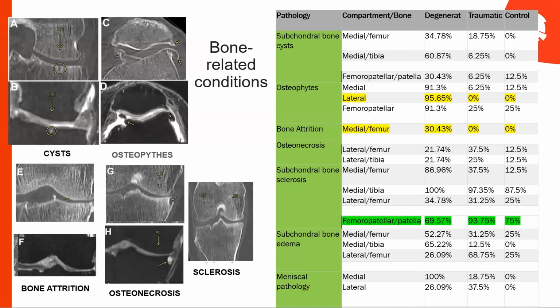While other parameters distribute among also healthy individuals, and some of the parameters, for instance, are not selective at all. So for example, subchondral bone sclerosis is a condition that we have been measuring in everyone: controls, aging population, and degenerated cartilage.